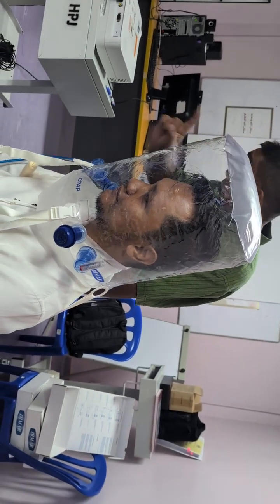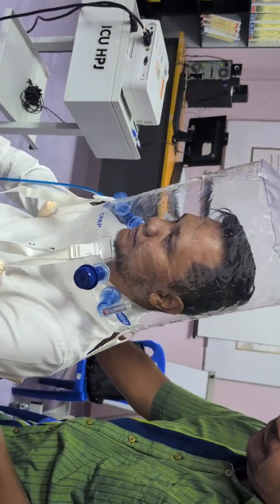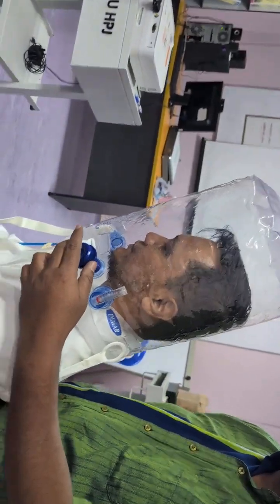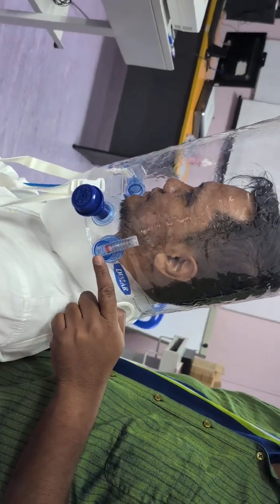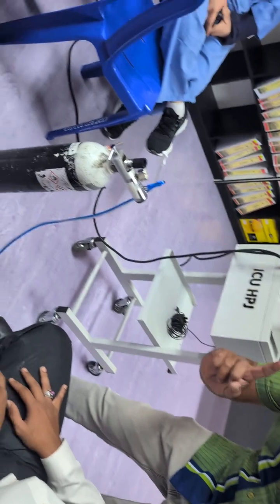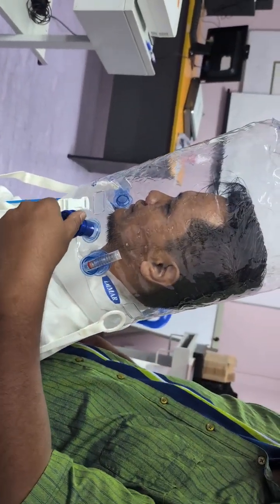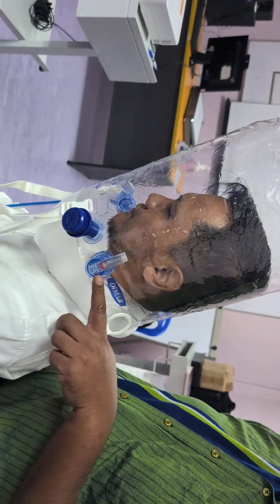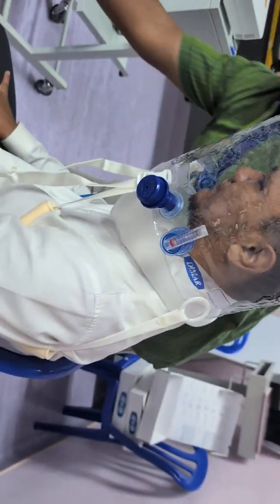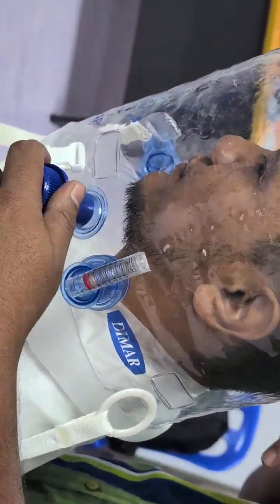The PEEP is maintained. Okay, I don't have a pen. My apologies. Turn this side. Again, this is mechanical. Okay, this is the actual PEEP which the patient is getting. All right. If I want to increase, I'm going to increase the PEEP. You see the PEEP increases. So what we want is maintained.